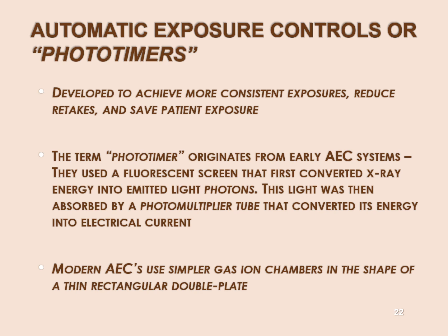You're relying on X-rays that not only penetrated the patient, the Bucky assembly, and the screen film cassette, but then they're hitting a fluoroscopic screen behind everything. So not exactly ideal as far as capturing the remnant beam.